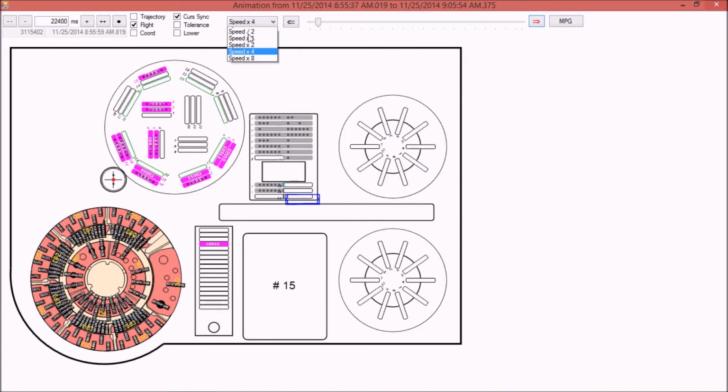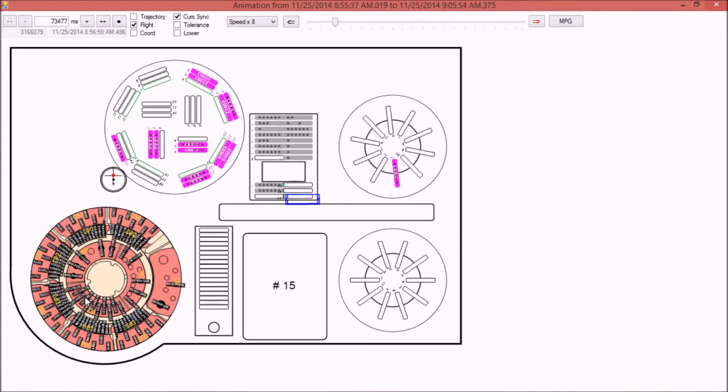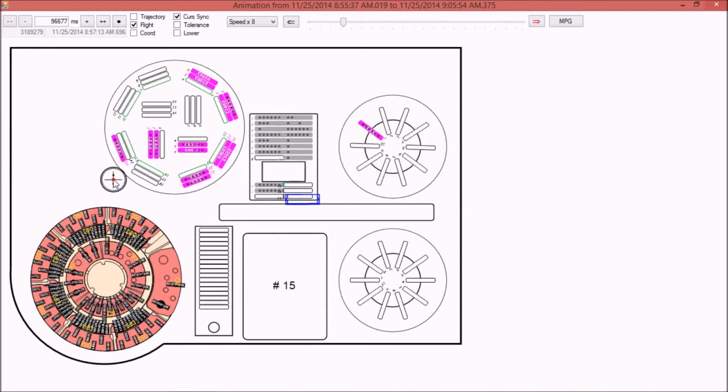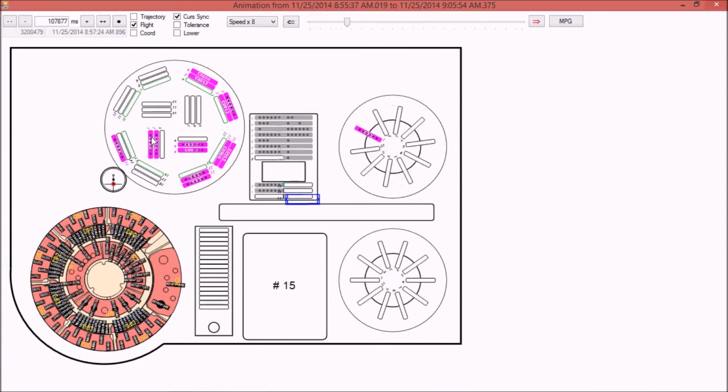For instance, we can go up to speed number 8 times the normal speed, and you can see the different subsystems moving contemporaneously. Of course, now we have the centrifuge spinning, we have this internal ring filled up with reagents that's moving to keep the reagents suspended. It is a mixture of different parts, so it must be agitated to be suspended. So we can see this big round thing, which is the incubator, while a pipetter, which is this red point moving, goes to each of these vials. Each of these rectangles is actually a consumable composed by different vials containing reagents.